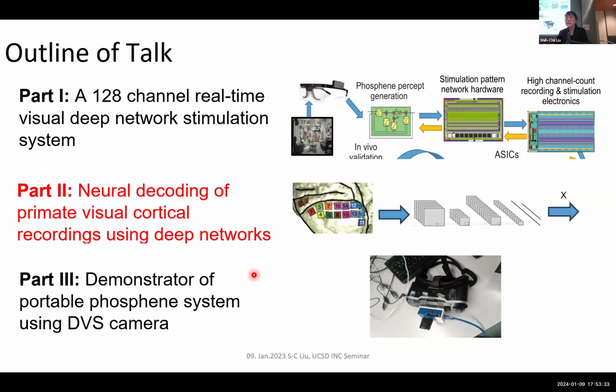Yeah, so it depends on where you put the electrodes, and you can look at the cortical map and know what the magnification is where you implanted the electrodes. And then with the phosphene simulator that Jonas or Rabut did, you can actually map it to where the electrodes will be sitting. So to make it more realistic, because you could have the same electrode put out the same current, and it could look like a little phosphene dot, right? Or it could look like a big phosphene dot, right? So they have a software that tells you what you would see.